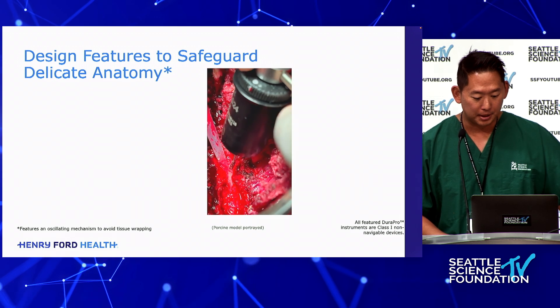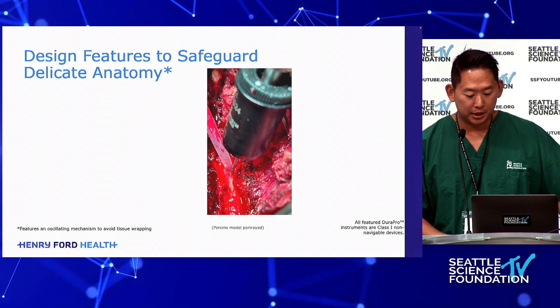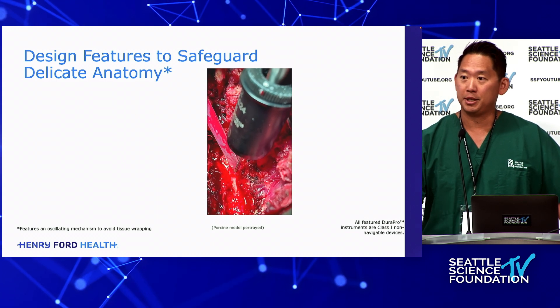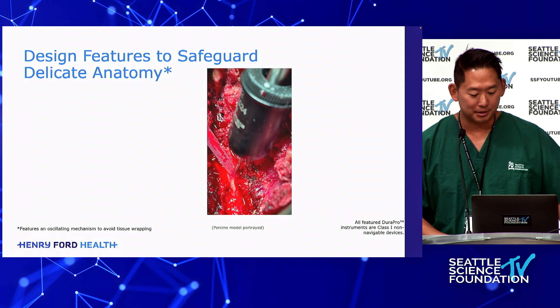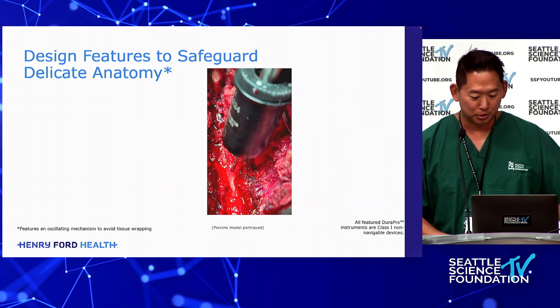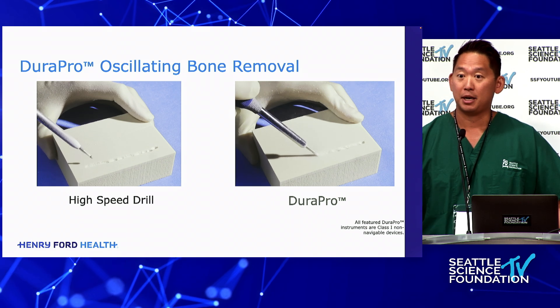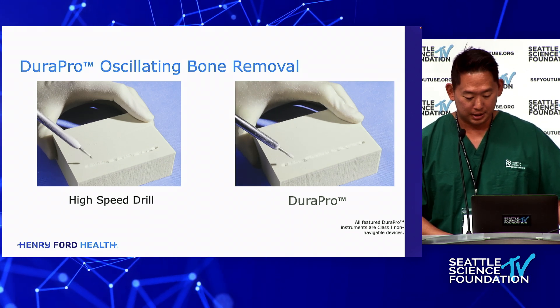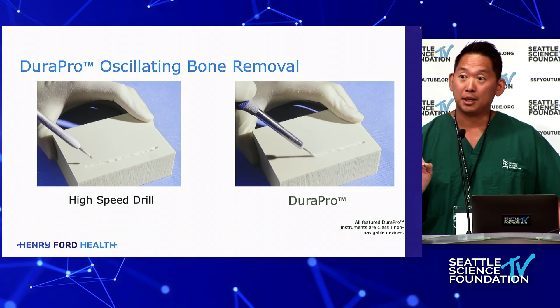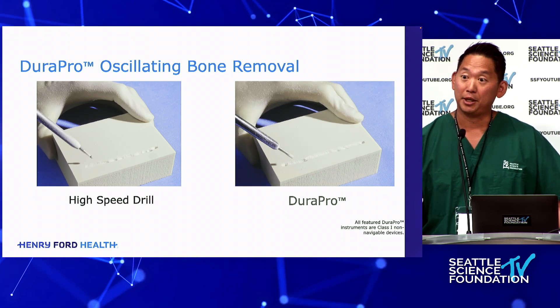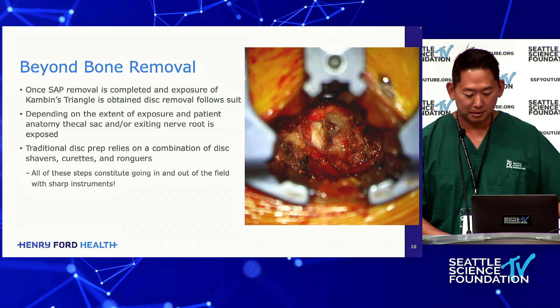This video is from a pig model — a live animal surgery — demonstrating the drill actually being placed on the dura of the pig. This is intentional; you wouldn't want to do this in a human, hence the pig model. There are some differences in the handling characteristics of the drill because it's not 360 degrees. This illustrates the cutting functions. It's still a side-cutting burr, with maybe 10 to 20% more manual force required when making a cut. Essentially, you use it the same way as any matchstick burr we're used to.